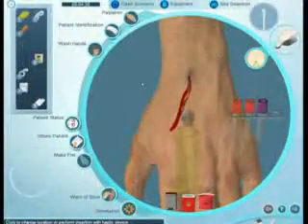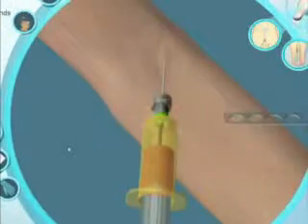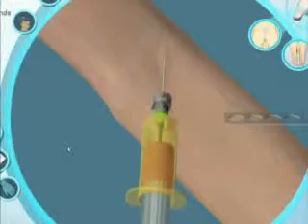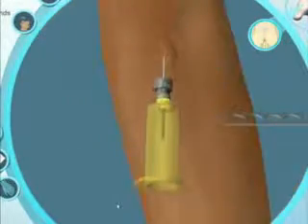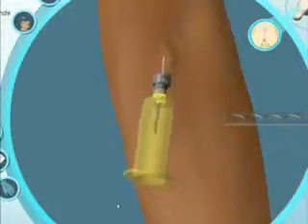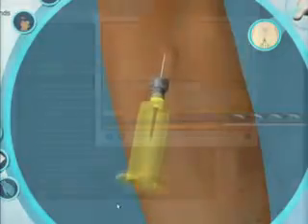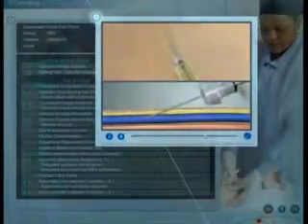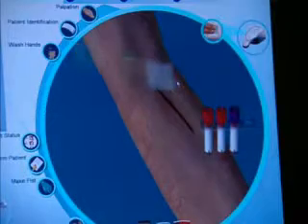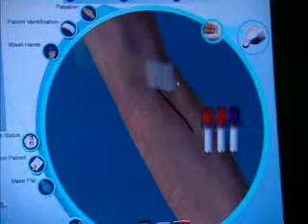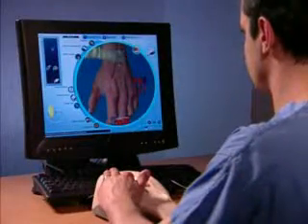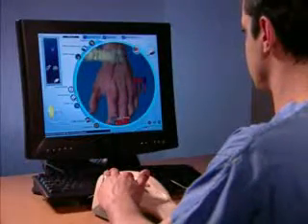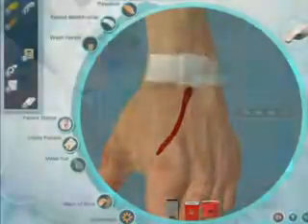Bleeding, bruising, vein engorgement, vein collapse, vein compromise, and vein rolling are just some of the pathologies and obstacles you will encounter throughout learning. A host of other complications force the learner to respond appropriately, while adding depth and realism to the learning experience.